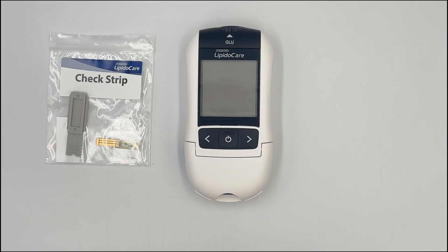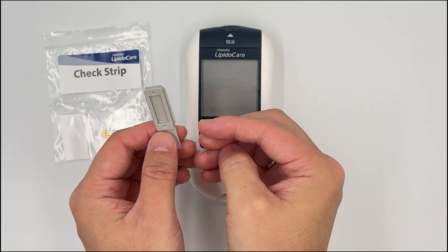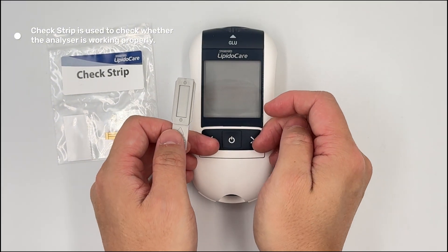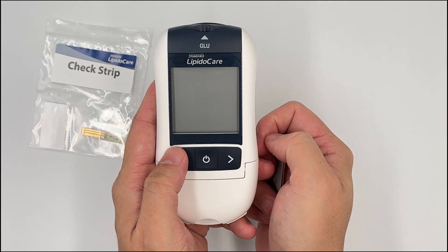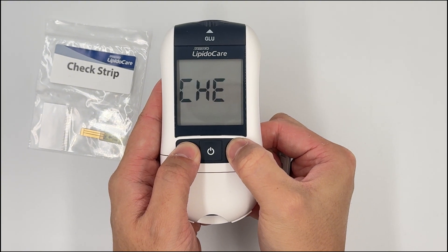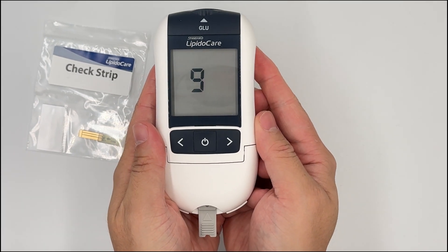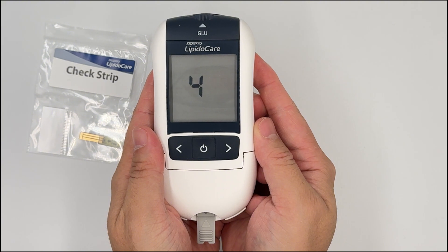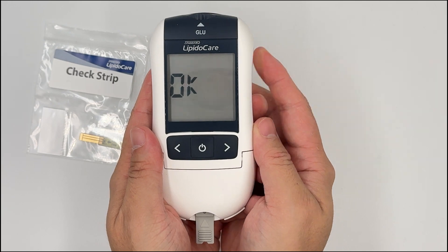Tip number three: if you want to check your lipid analyzer, there is a check strip inside the box. This strip checks if the system is working properly. To use it, switch on your meter, then hold these two buttons to enter checking mode, and place the strip in. It will start a 10-second countdown, and if the analyzer is working properly, it will show you an OK.